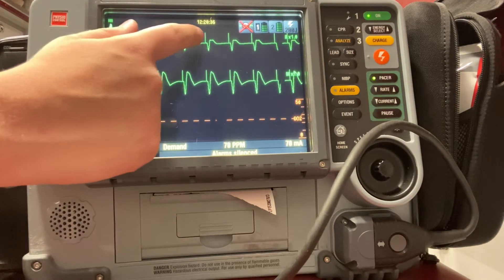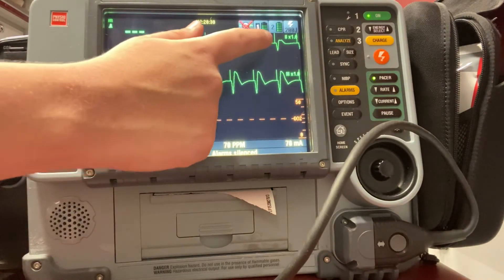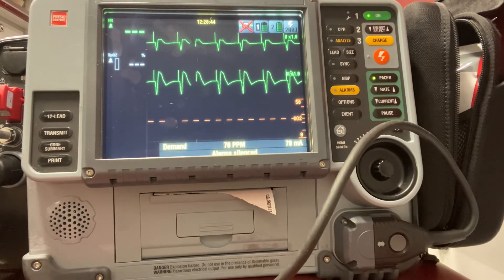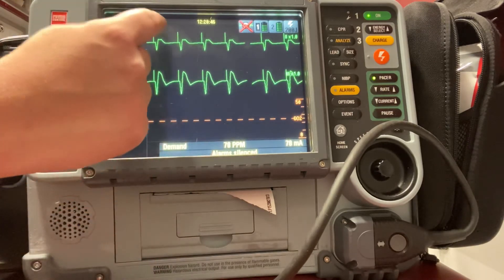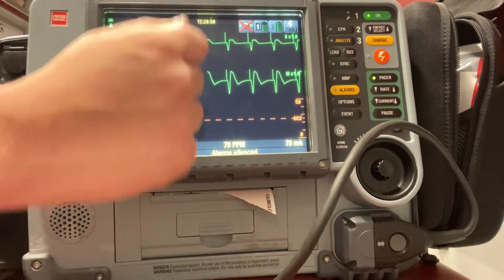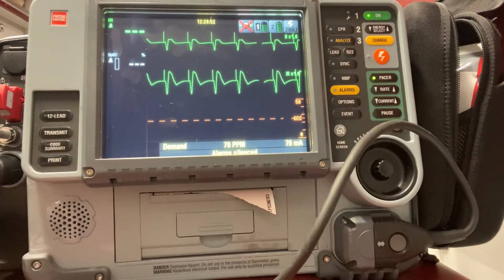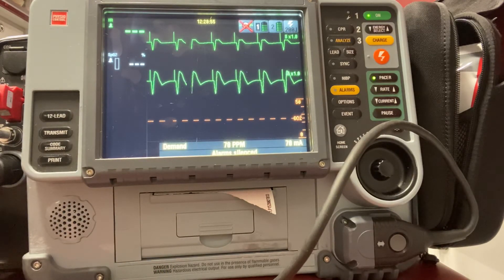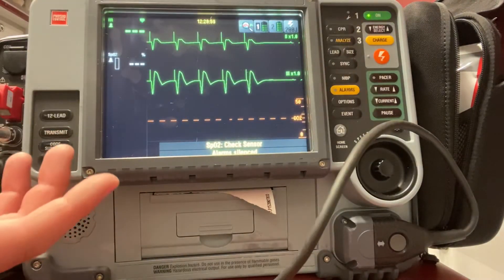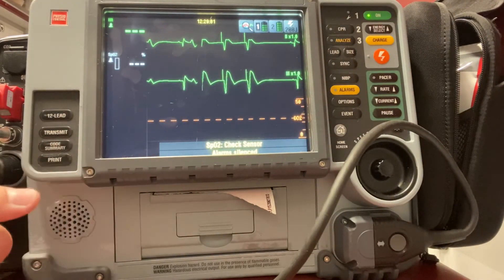I do have a wide QRS here with my pacer spike. That's because the pacer works on the ventricles of the heart, so it will be a wide complex for transcutaneous pacing. I should see that pacer spike march up and that QRS widen, so I can see the wide complex. We don't typically take our patients off pacing, but if you were, you would just go ahead and turn off your pacer by hitting the pacer button again.